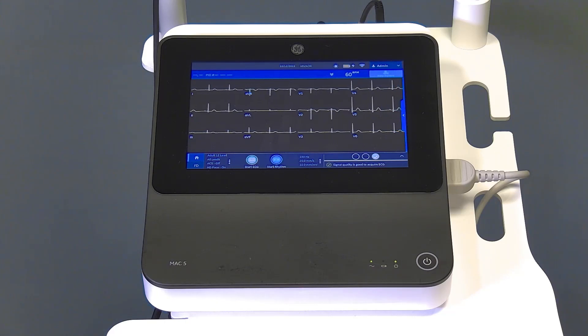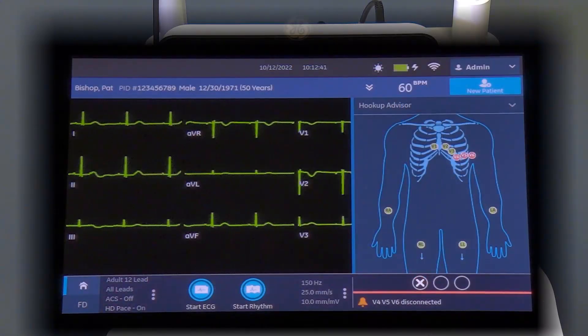Please review your facility's process for proper ECG electrode placement and protocols. Once you begin attaching the skin electrodes, the hookup advisor will appear on the screen. If possible, begin with lead RA to ensure prompt hookup advisor activation. The individual leads will change color from red, yellow, to green depending on the quality of the connection. An overall quality indicator is located below the hookup advisor.